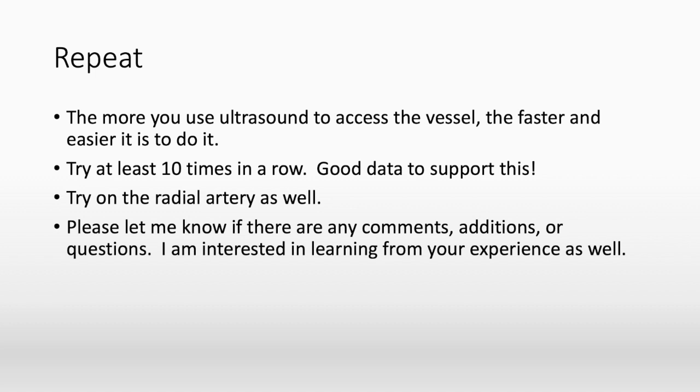It goes without saying that the more you do it, the easier it will become. There's good evidence to support using it after 10 times in a row. Your learning curve starts to flatten out a little bit, it becomes easier. And you may consider using it routinely on the radial artery until your tactile feel is such that it's second nature.